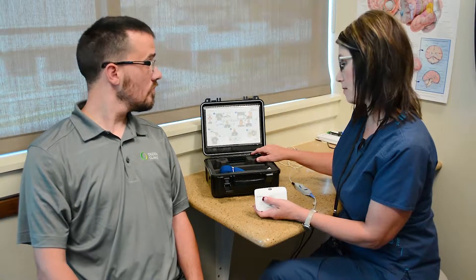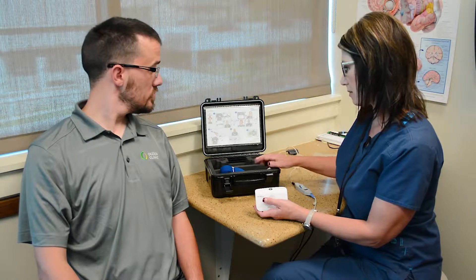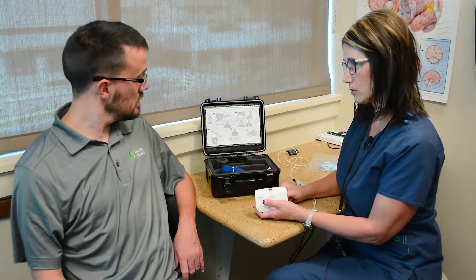We are going to be doing the home sleep study on you tonight. We'll be using this Alice Night One. It does give us picture step-by-step instructions, but I'm also going to walk you through each step.